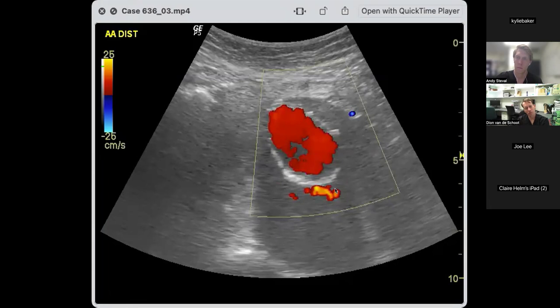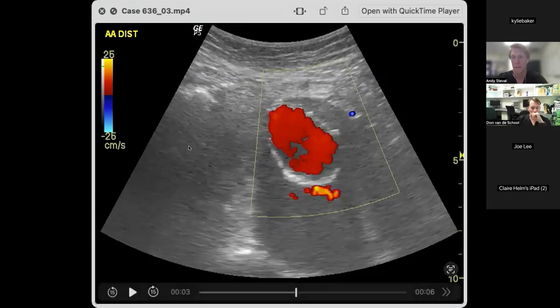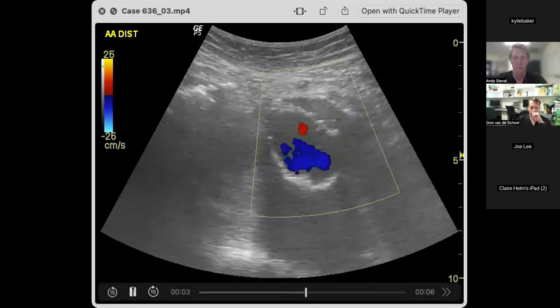And if the color stays in the same place, then it's probably an anatomical feature, not an artifact. Artifacts tend to move as you move the probe, whereas the anatomy doesn't. I mean, the image sort of rotates. It looks like it's something, but in terms of its relations, yeah. So all of those things.